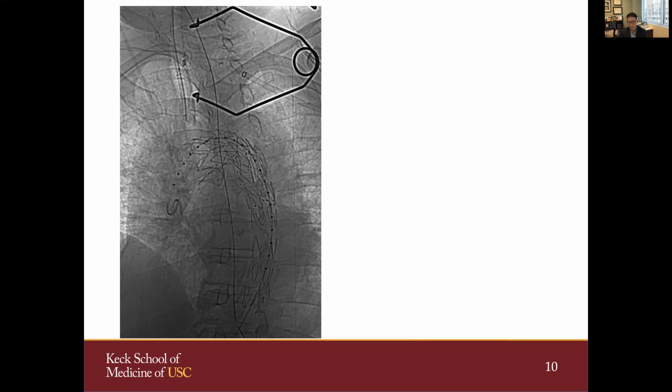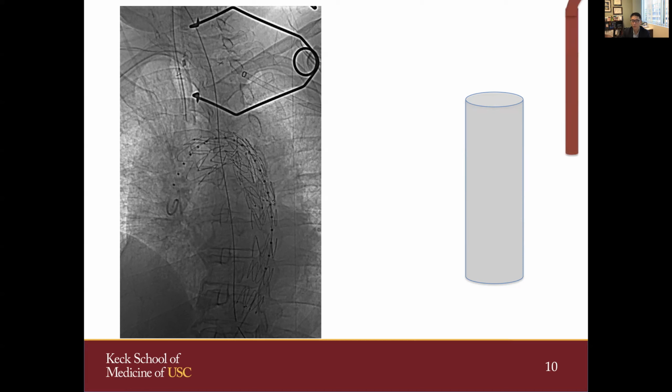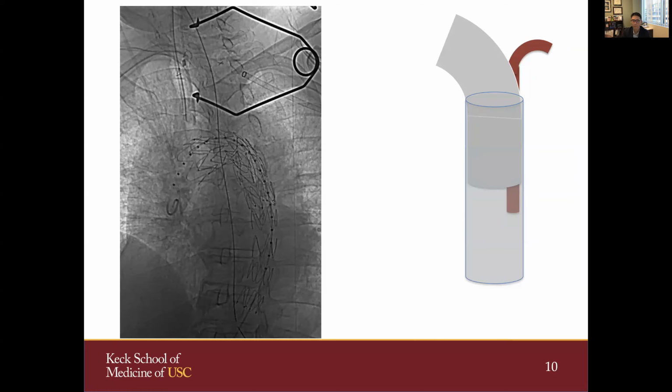As the name suggests, we run the branch stent in a periscope or downgoing fashion that you see here, and it is sandwiched between the aortic pieces. Typically, we use this for the left subclavian artery. So the steps are: we first deploy the aortic stent graft distal to the subclavian artery origin, and typically through a brachial artery cut down on the left side, we introduce the branch stent in periscope fashion, which is then sandwiched with another proximal aortic stent graft within the first one, landing just distal to the carotid artery.